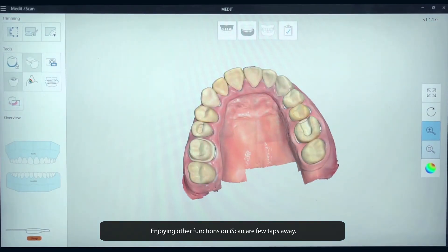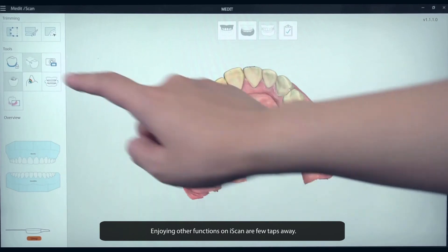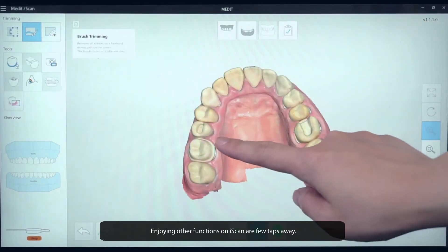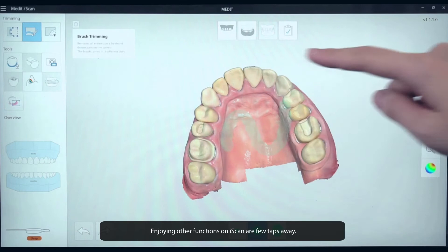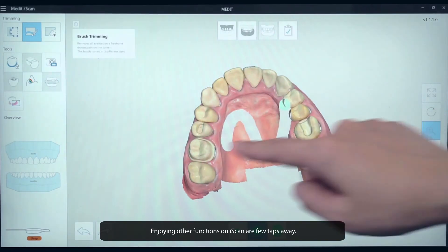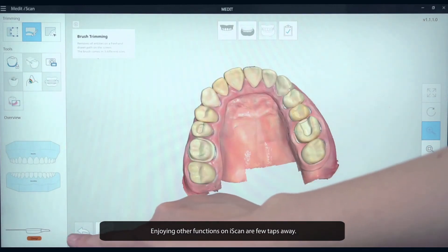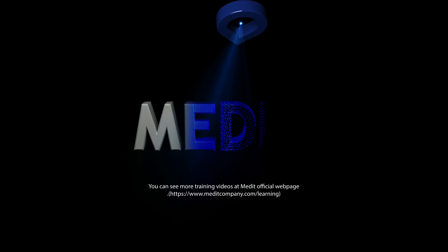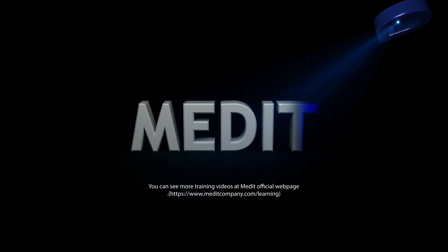Enjoying other functions on iScan are a few taps away. Thank you.